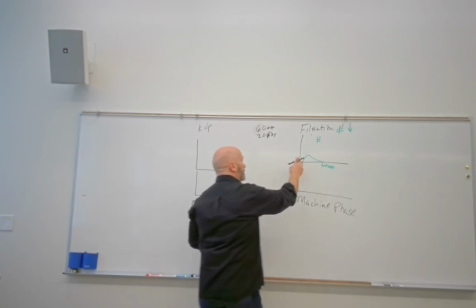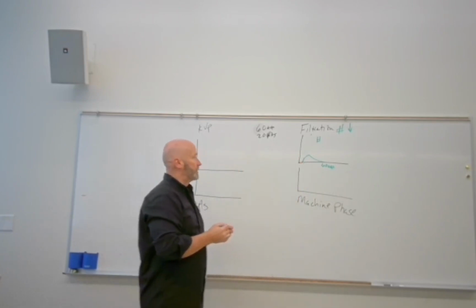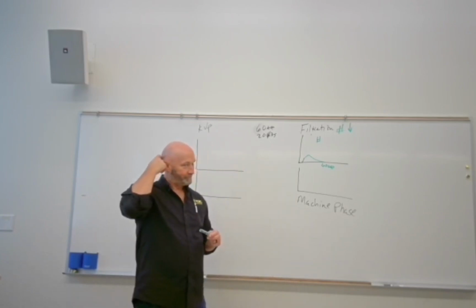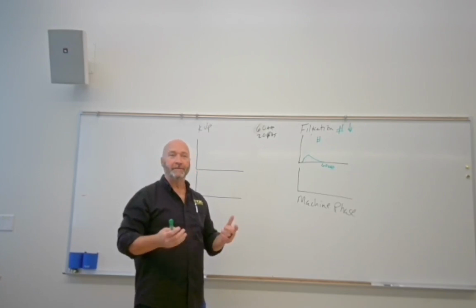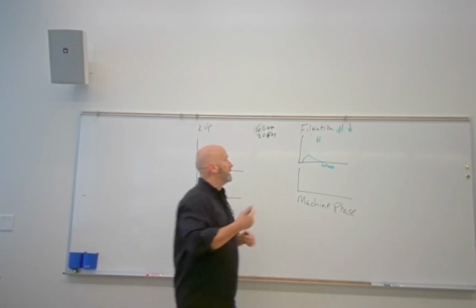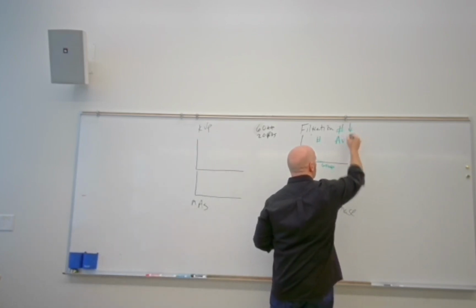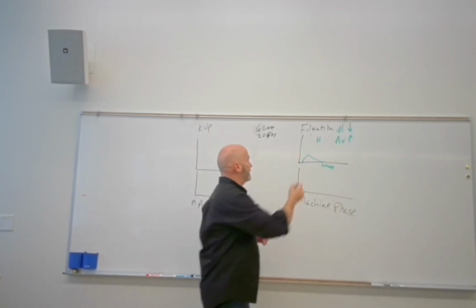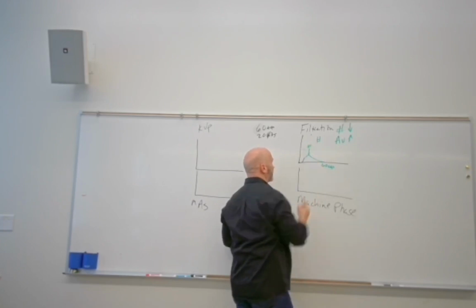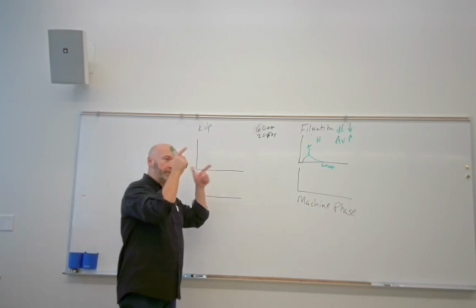It also took out all those lowest energy X-ray photons, which means that, let's say I throw out your lowest grade this semester, then our average goes up, right? So average goes up, our numbers go down, and it pushed this thing toward the high energy side. The peak of the bubble represents average.